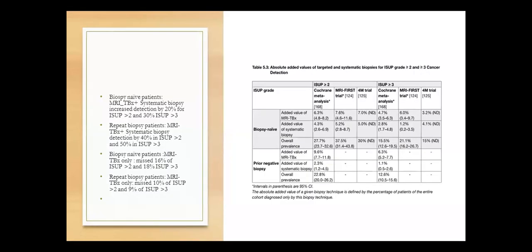So the biopsy in this analysis, the table, we see that this is from the EAU 2023 guidelines.